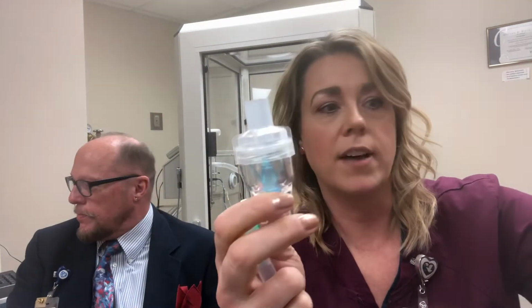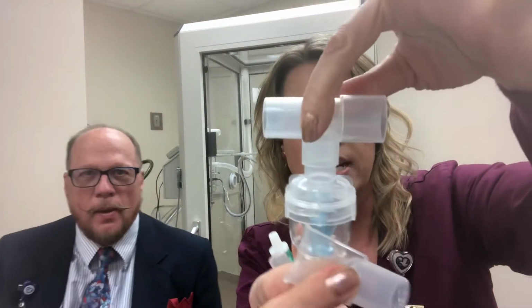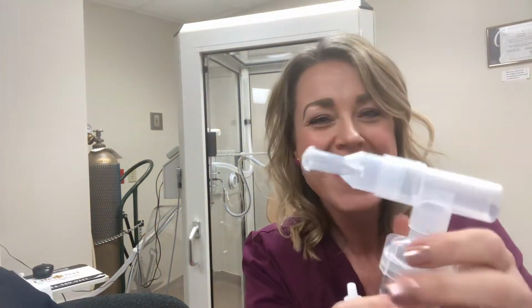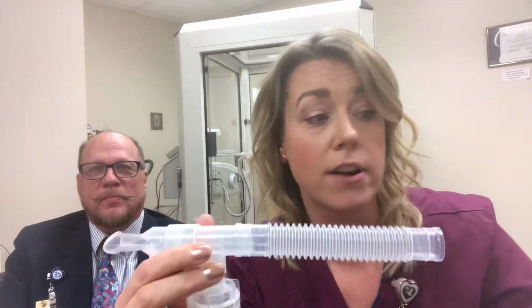It comes in several pieces. You've got the neb cup, you've got the mouthpiece, you've got a little T. The T goes on here. The mouthpiece can only go one way. You have this little guy that's going to go on the end. Now, again, this is only for non-COVID patients because we don't want this coming out into the air, right?